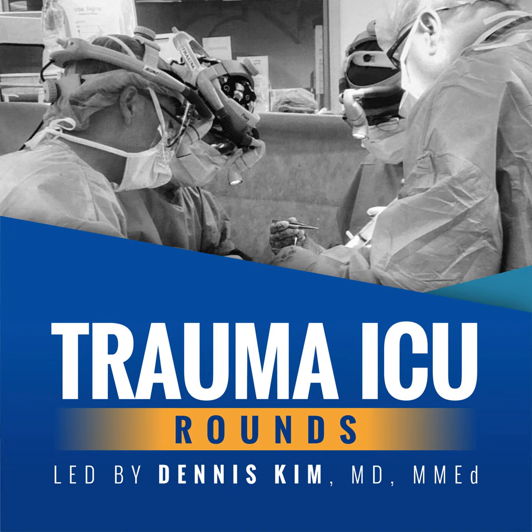So when we say we're discontinuing ventilation, this implies, hopefully, permanent removal of the ventilator, whereas the term liberation has been defined as the ability to breathe without the assistance of the vent, as may occur when a patient, for example, performs a T-piece trial successfully or a pressure support ventilation trial successfully. Finally, the term weaning, this isn't something that we typically do, at least not in the trauma surgical ICU too often. This really refers to the gradual reduction of ventilator support and its replacement with spontaneous ventilation.